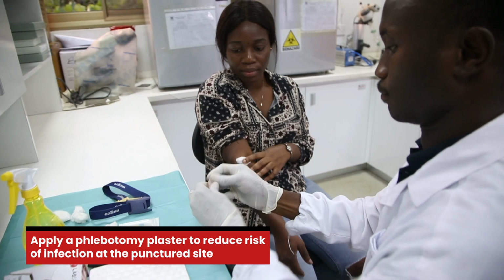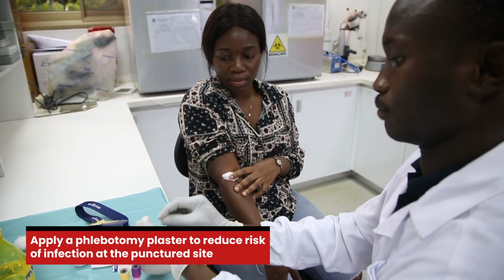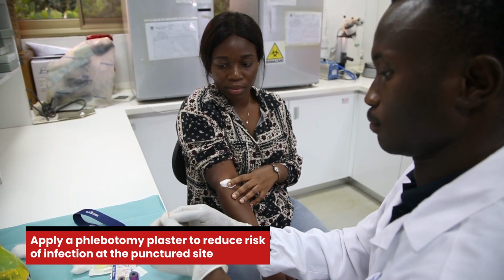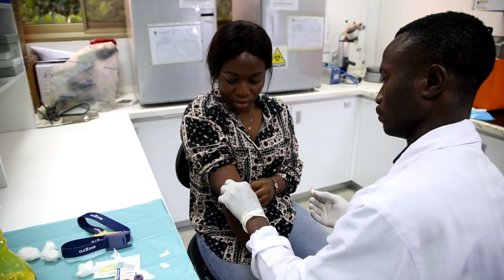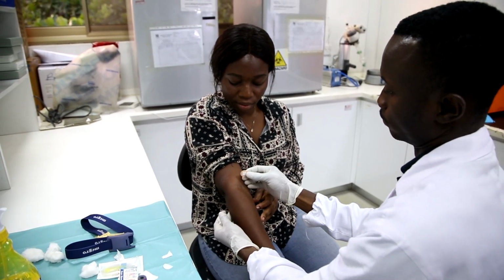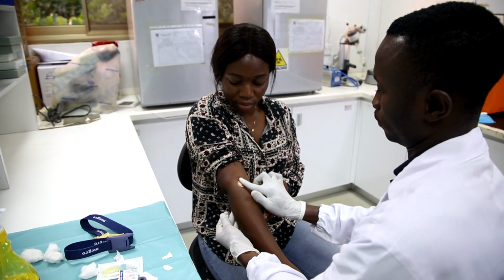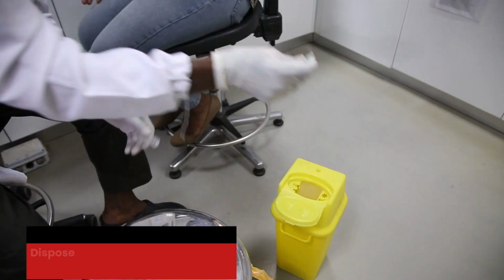Ask the patient to continue to press it firmly for at least 2 minutes, after which a phlebotomy plaster can be applied to reduce the risk of infection at the punctured site. Here, consistent firm pressure is essential to reduce the risk of hematoma forming or prolonging the bleeding.